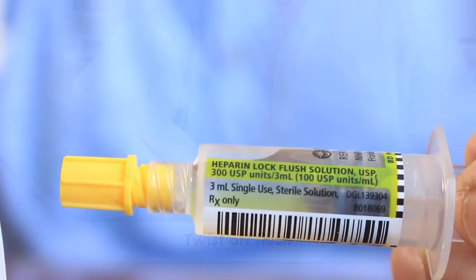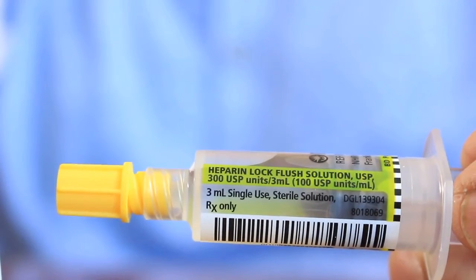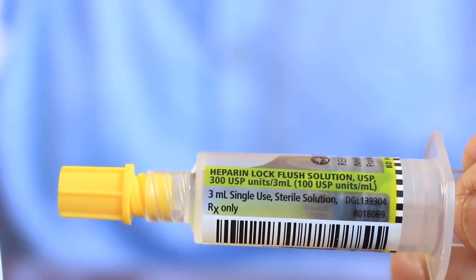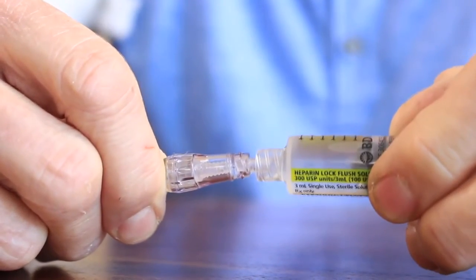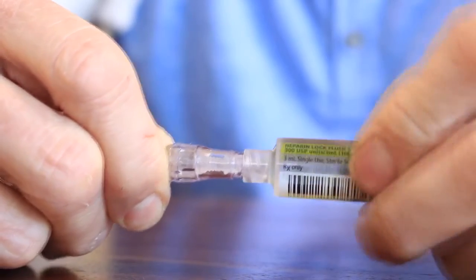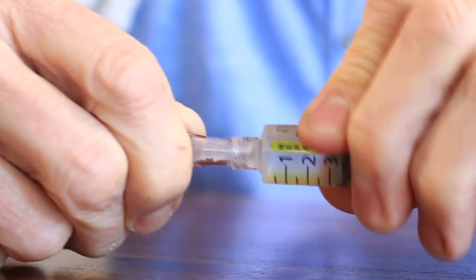If you were told that you need to finish off by putting some heparin, which is a blood thinner, into your line, you need to scrub the hub again with alcohol and then twist on the heparin syringe and push the plunger until the right amount of heparin has gone in. You only use heparin, though, if you were told that you have to. Not everybody needs heparin.